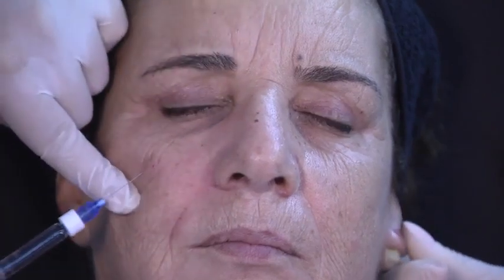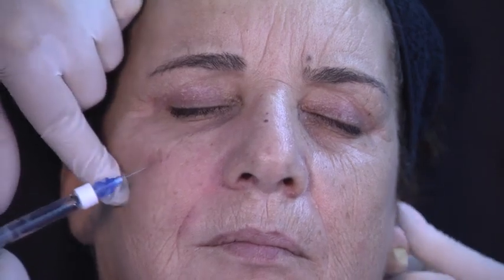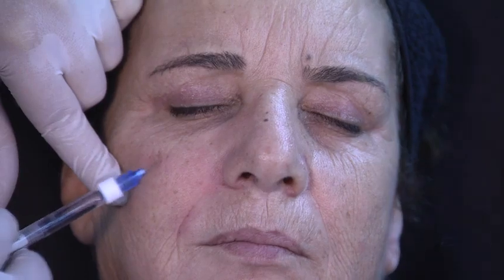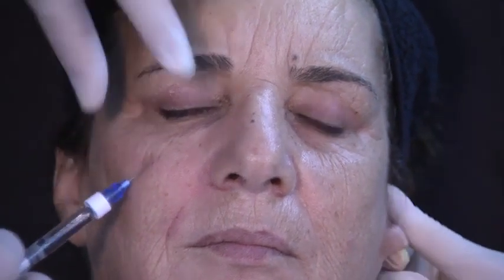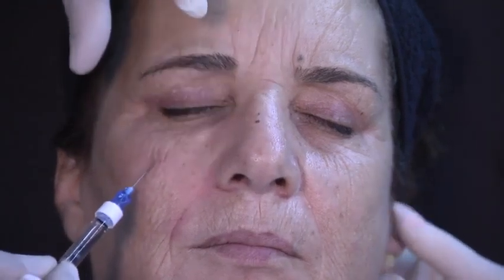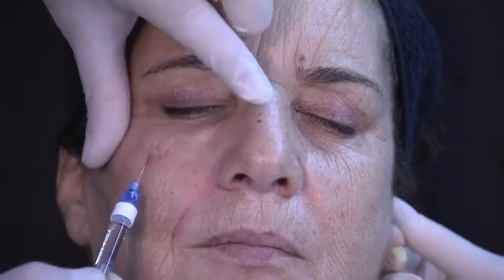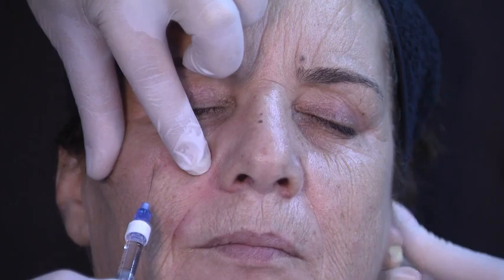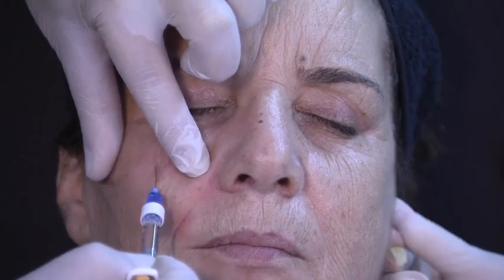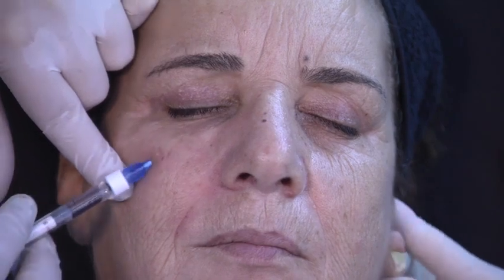This is Vital Light. The Vital Light goes superficial. No, I'm going to go deep first. Remember, superficial in the teardrop is not a good idea. It's just because you are an advanced audience that I did it. Okay. But first, I will continue with the deep plane a little bit only. Okay, I will do the superficial at the end, only for very advanced injectors and people that can think of having a little bit of water retention, if it happens 3 times in 3 years in my case.